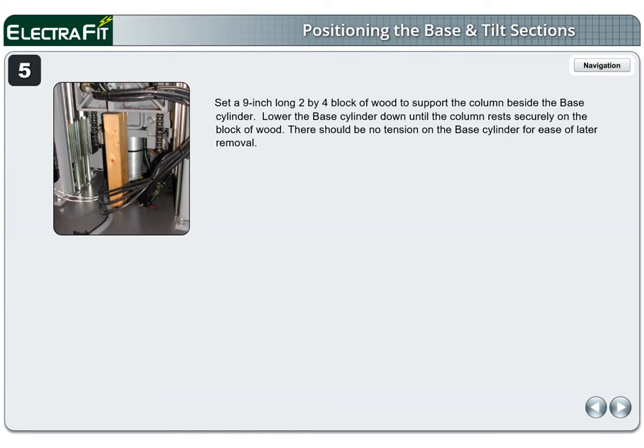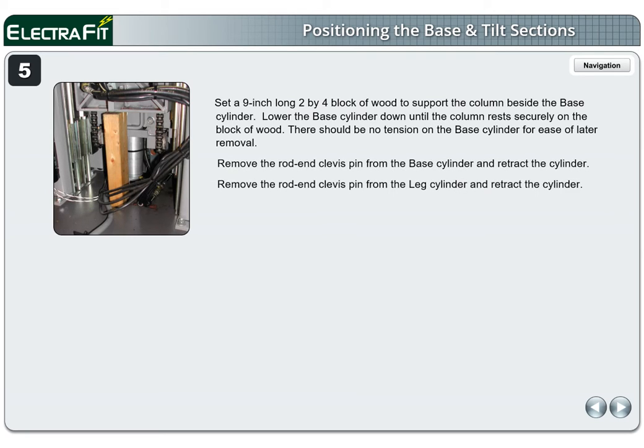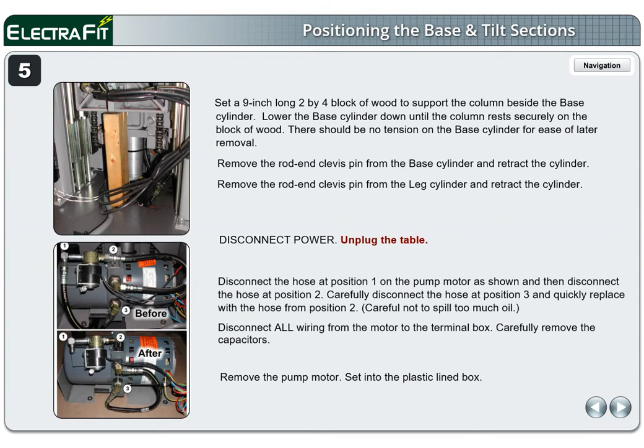Page 5. Set a 9-inch long 2x4 block of wood to support the column beside the base cylinder. Lower the base cylinder down until the column rests securely on the block of wood. There should be no tension on the base cylinder for ease of later removal. Remove the rod end clevis pin from the base cylinder and retract the cylinder. Remove the rod end clevis pin from the leg cylinder and retract the cylinder. Disconnect power and unplug the table. Disconnect the hose at position 1 on the pump motor, then disconnect the hose at position 2. Carefully disconnect the hose at position 3 and quickly replace with the hose from position 2 — careful not to spill too much oil. Disconnect all wiring from the motor to the terminal box. Carefully remove the capacitors. Remove the pump motor and set into the plastic-lined box.